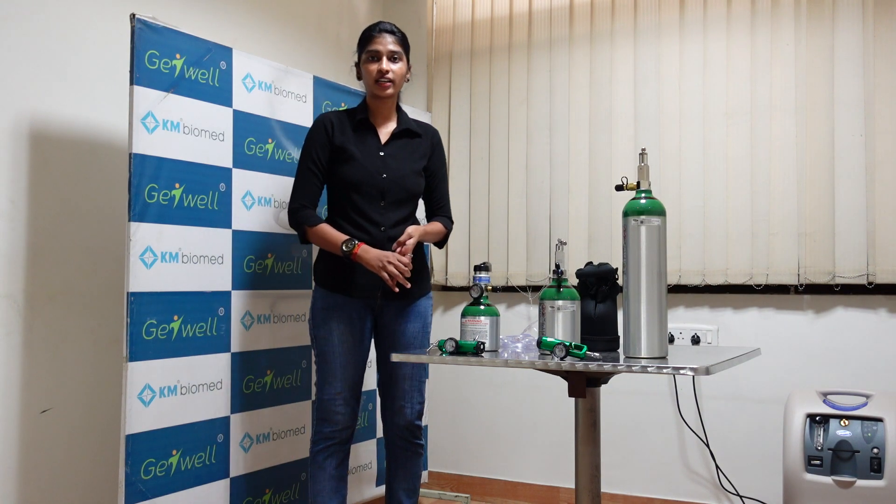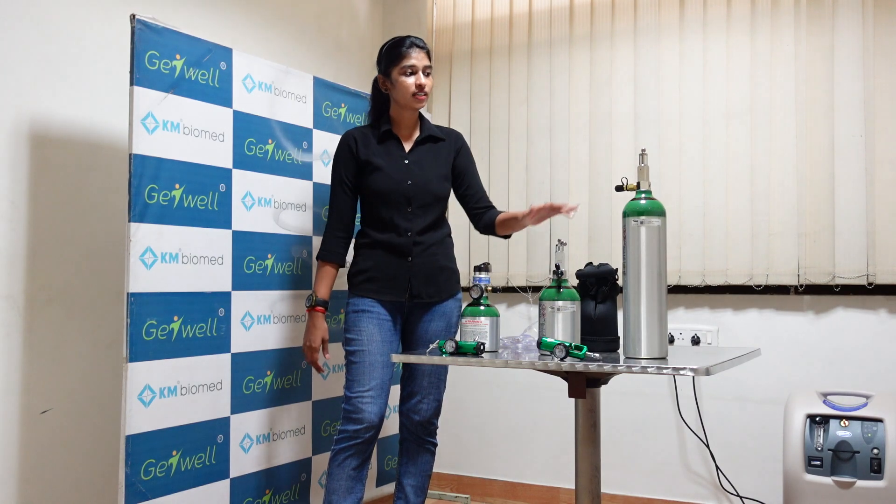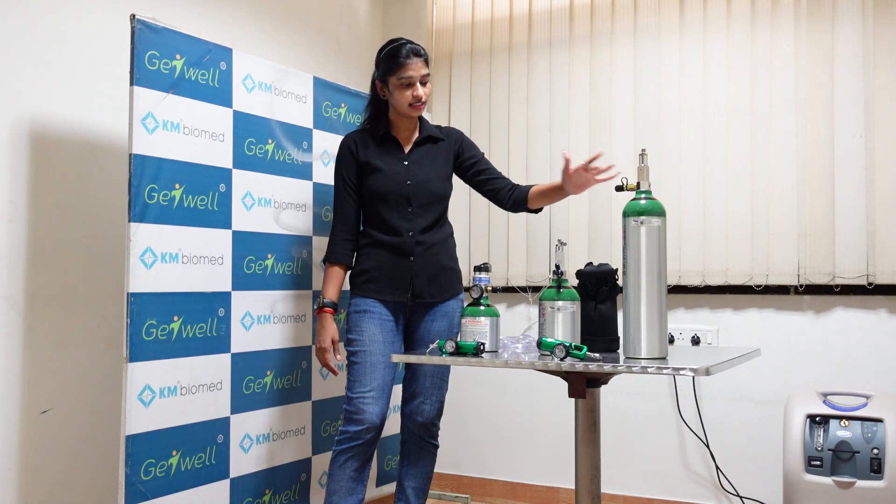There are 4 types of InvaCare oxygen cylinders. The sizes are ML4, ML6, ML9, and D10. Currently we have 3 types with us, so I will explain you the different types of cylinders.